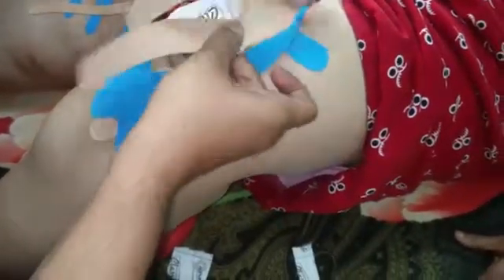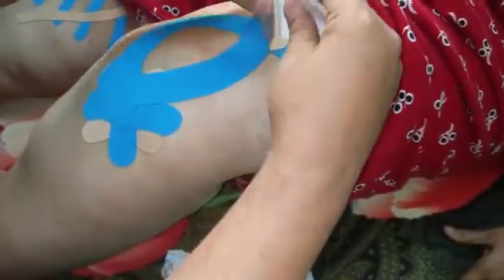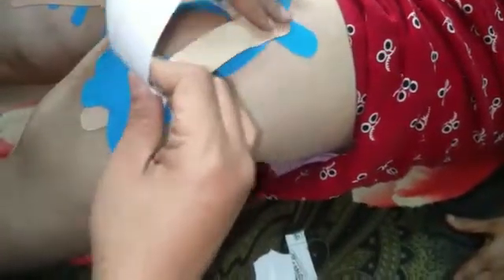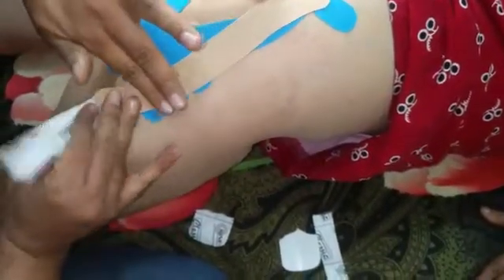Similarly, I will be going on the top of the knee joint and tear off the tape. There is no relation of these two tapes with each other. It's essentially to stabilize the knee and give patients support for pain relief as well as enhancement of functioning.